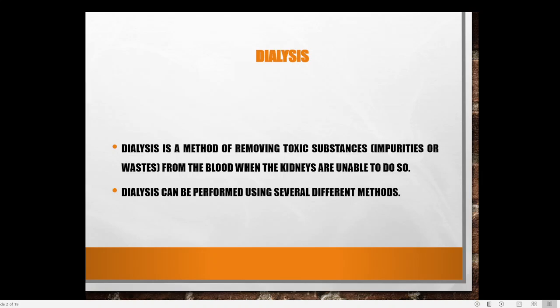You may have heard about dialysis, because when some people are having some kind of problem with the kidney and their doctor says that your kidney is not working, the only option is to use some kind of artificial kidney or artificial filtering device. That device is usually known as the dialyzer, and here we will be removing the waste material from the blood, and after removing the waste material, the blood will be pumped back into the body.